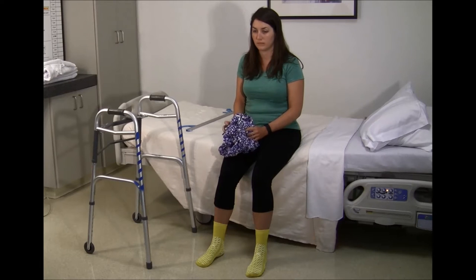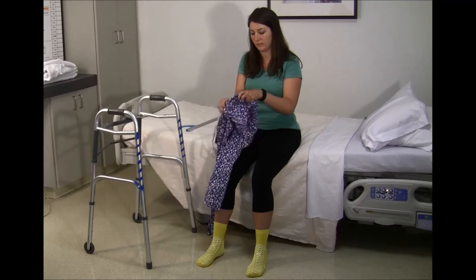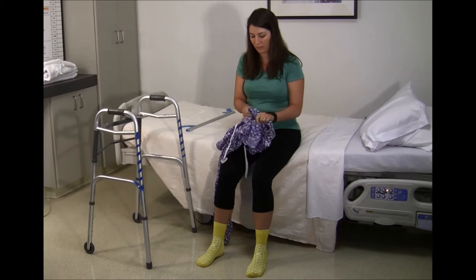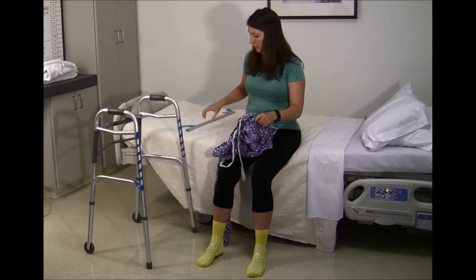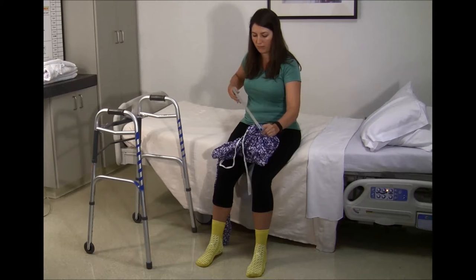To use for dressing tasks, pinch the front waistband of the leg you want to dress first — your operated leg — while sitting in a stable, appropriate height chair or on the bed. It may be helpful to gather the material as much as possible before pinching the waistband. Use the reacher to lower the pants towards your toes and place your operated leg in the pant leg.